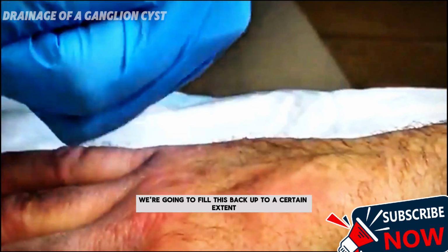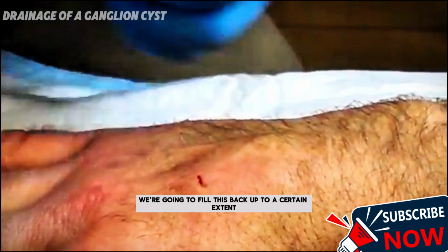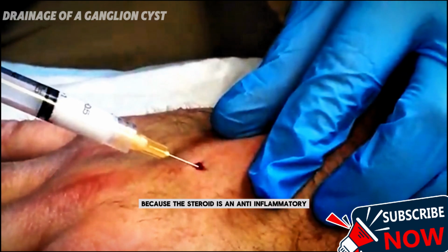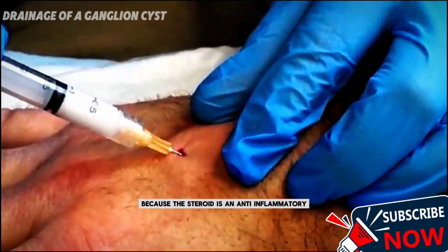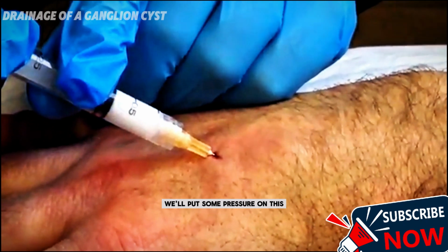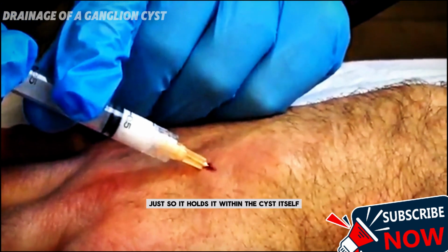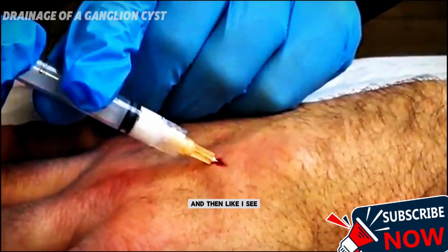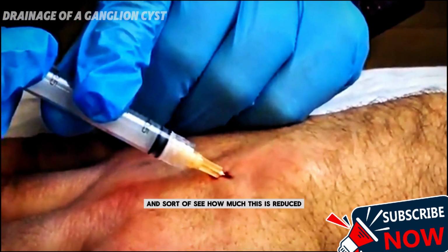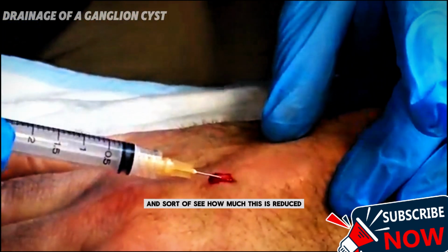Now clearly we're going to fill this back up to a certain extent, but I'm not worried about that because the steroid is an anti-inflammatory. I'll put some pressure on this just so it holds it within the cyst itself. And then we'll have Chris follow up in a few weeks' time and see how much this has reduced.